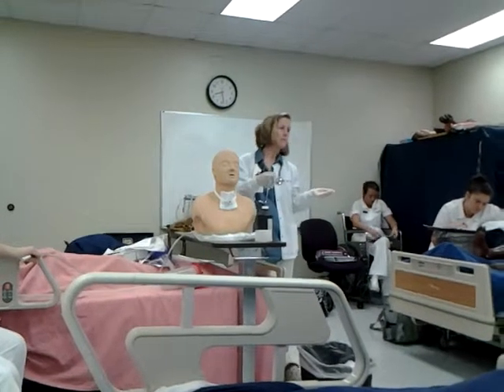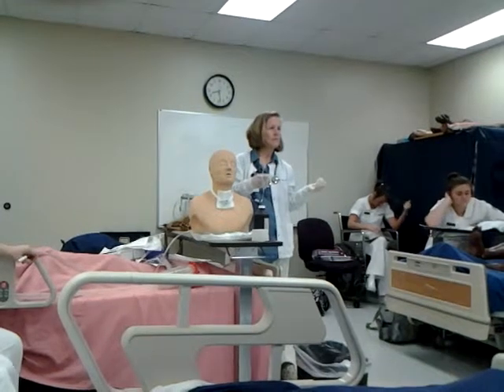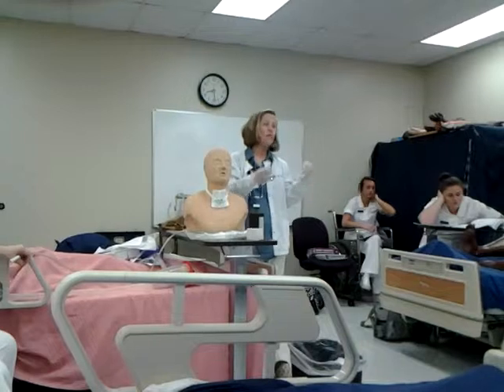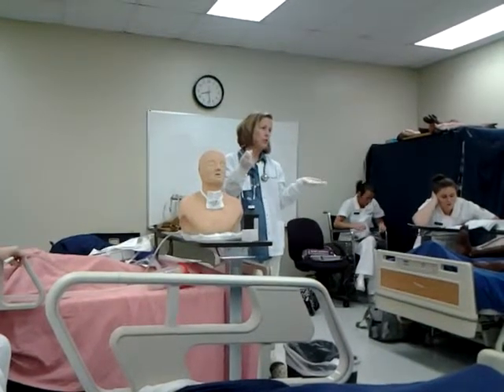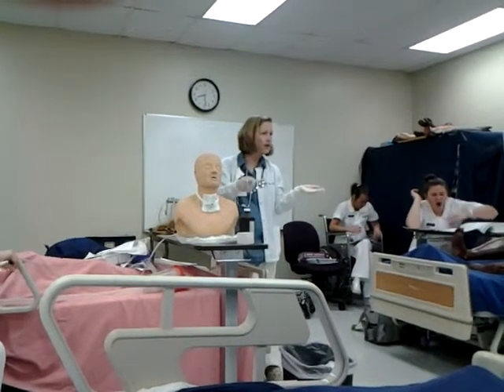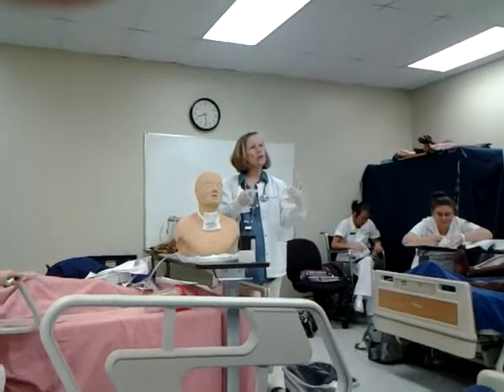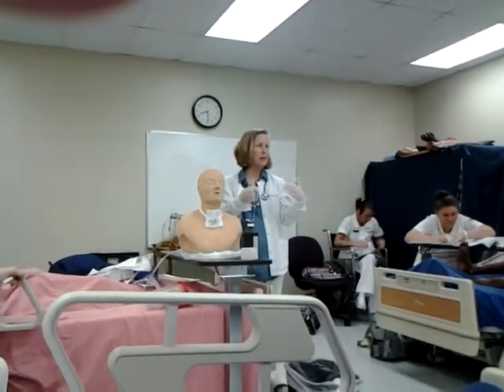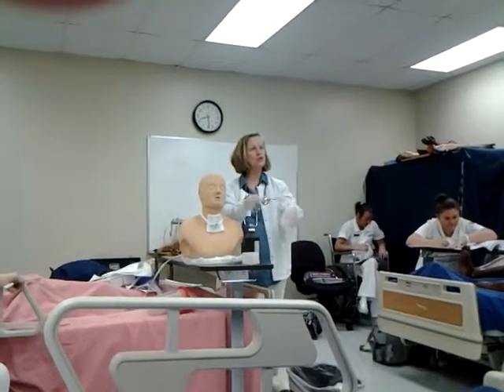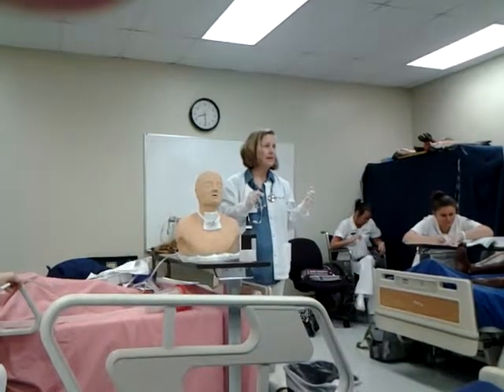Well, the reason I asked is I've had a patient before that was, I don't know if he was embarrassed or what, but he did not want to say that he did it. I would probably, and that might be an education thing that you could do. You could talk to him and find out if he is embarrassed. Have him talk through it. You tell me, I know you don't want to show me, and I respect that. Can you tell me the steps that you take in suctioning your trach? Or at least I know you know how to do it.